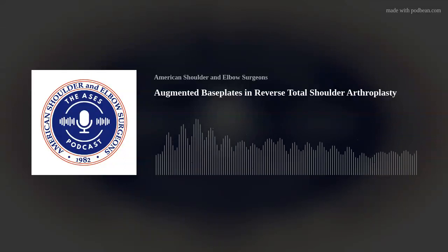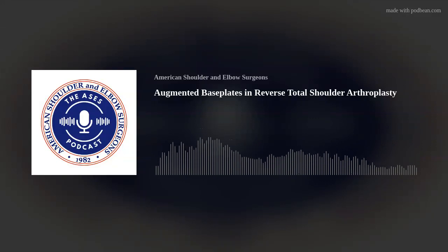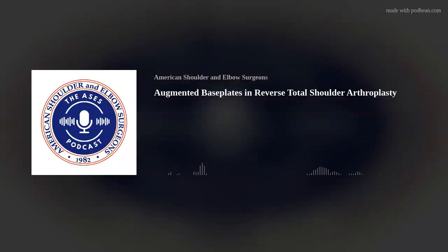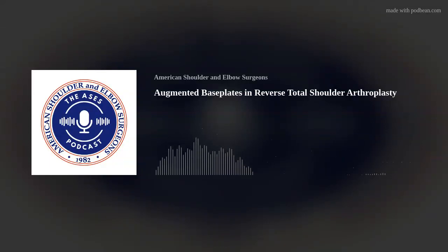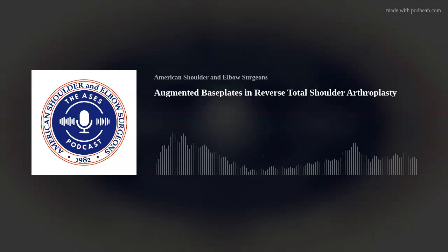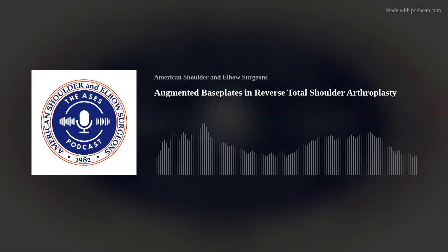So similar to what Andy said, I don't typically use an augment in this situation, and I'm trying to get them back to neutral inclination version. And if I need to, I will. I don't plan every one of these cases.